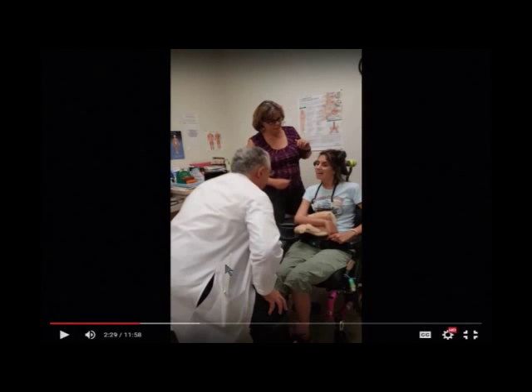So we didn't see that on the pre-treatment because we didn't tape it properly, but on the first examination on the left side, she couldn't see anything on the top and the bottom. That was half of the vision that was gone, which is why her head was tilted. On this one, she could see it on the bottom half, but not the top. And that enabled her to keep her head straight, which is a big deal. And so that was part of the neurological recovery that she had 5 to 6 weeks, and then this one is 6 months later. So she's maintaining her improvement.